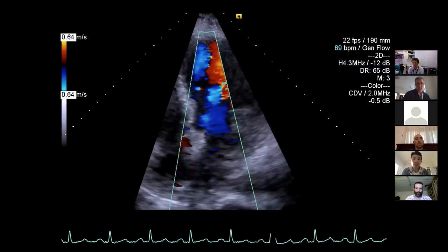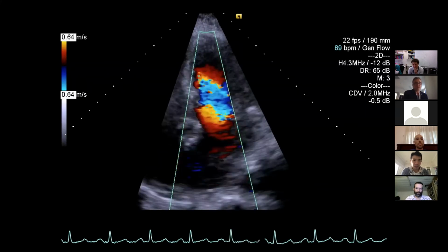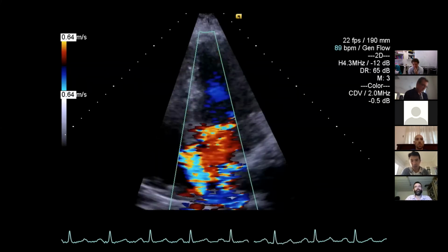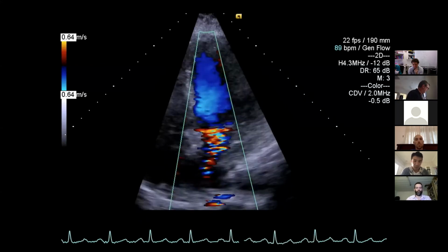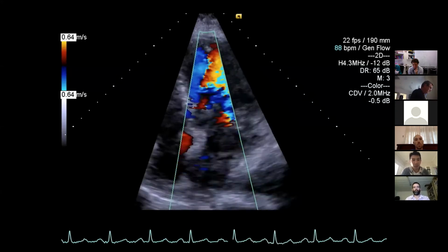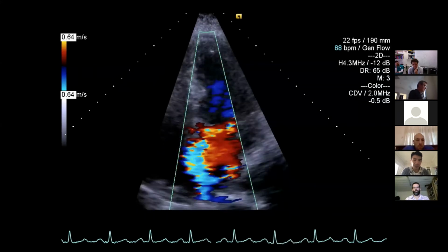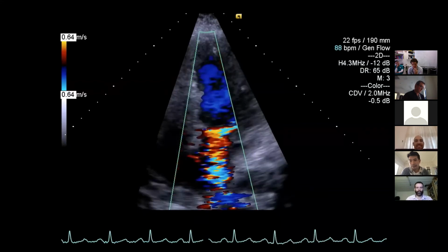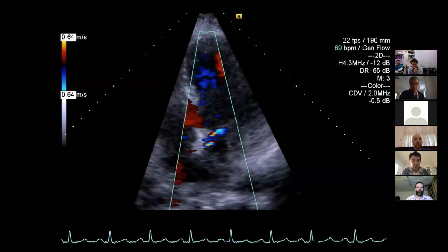What am I measuring here? Well, this is a qualitative assessment of the MR jet severity, and you can see that the chamber is filled more than 40% on estimate of the left atrial size. There's a good demonstration of the eccentric jet Coanda effect. Nice. And what's the problem with the 40% measurement? Well, it's only qualitative, it's not quantitative.